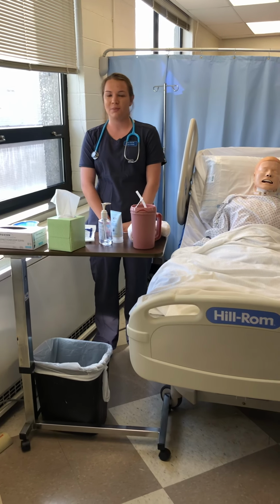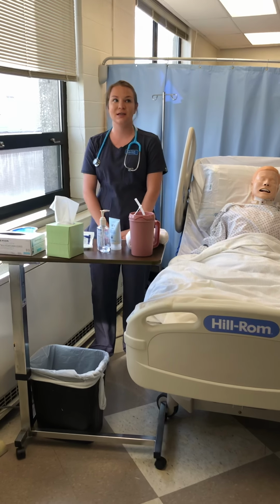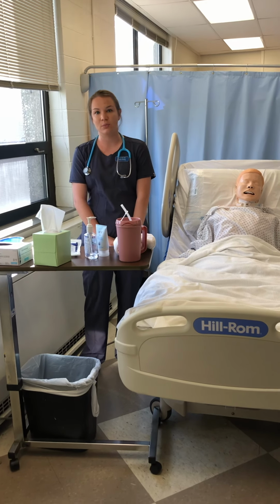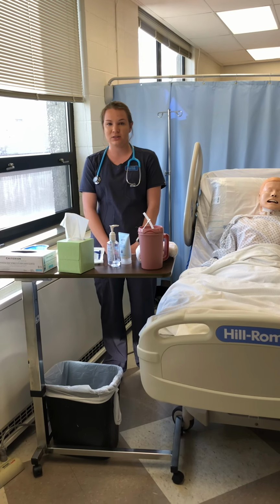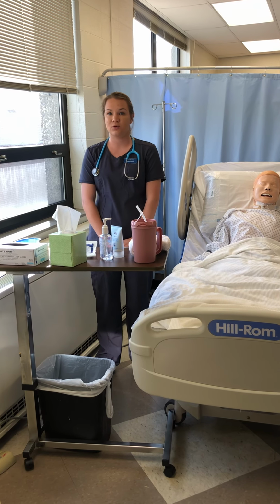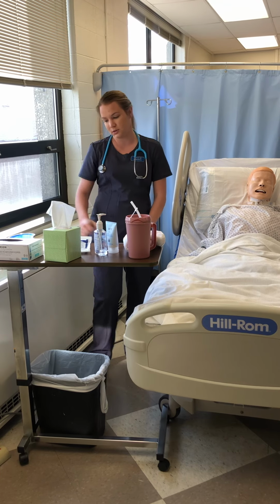My name is Nicole Otto. I'm in 4th semester. Today is April 16th and it's about 8:15 in the morning, and today I'm going to insert an NG tube. Before I begin, I want to make sure I have a physician's order and look at my client's history to see if he has had any recent nasal surgeries. So let's get started.